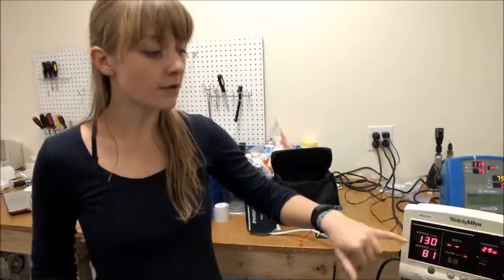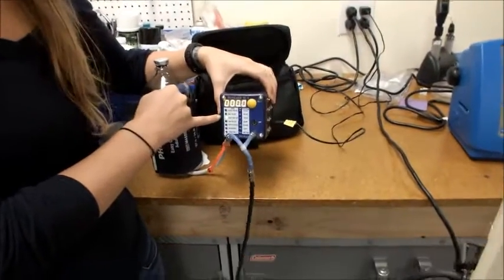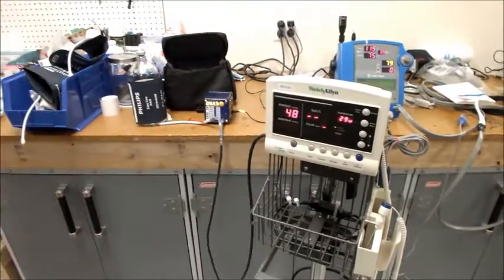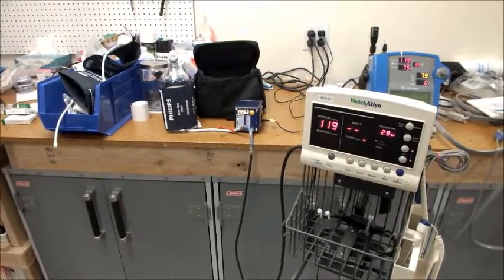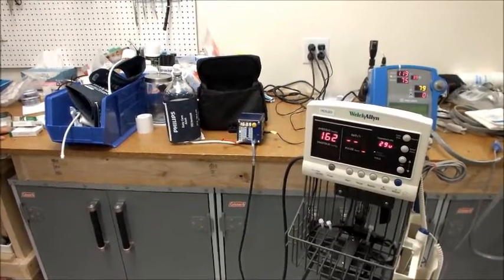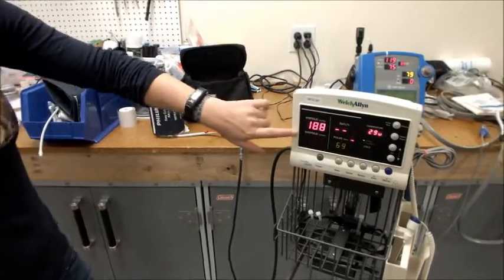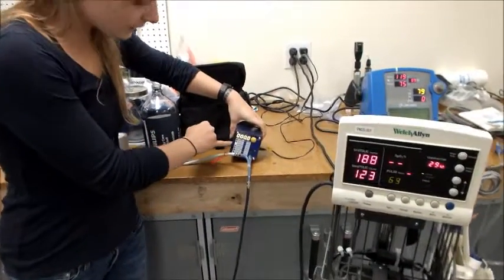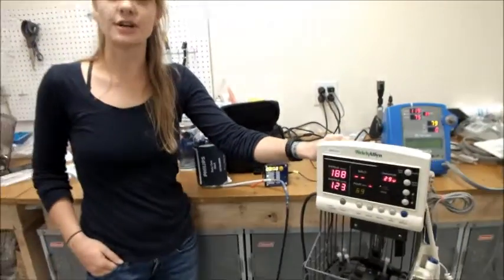Once you get an accurate number within five of each value of the systolic and diastolic pressures, you're going to go back to the SimCube and press the yellow button until you get to high blood pressure. Once you're there, run the test again. It looks like you have a reading of 188 over 123. This is fairly close to our desired reading of 190 over 120, which means that this machine works for high blood pressure — which is great.